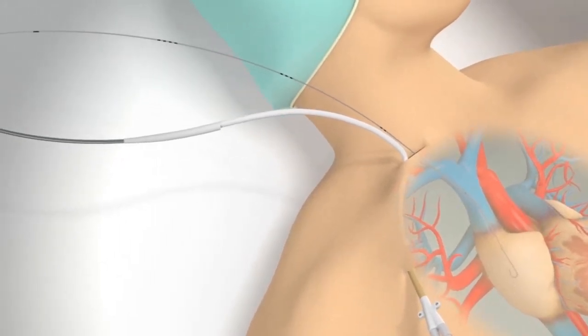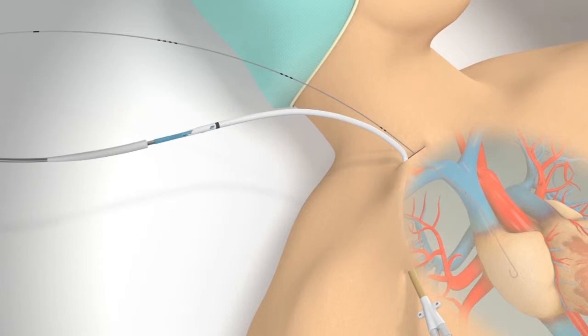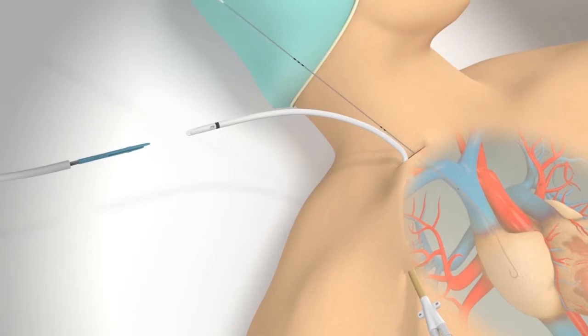Remove the catheter carefully from the tunneling stylet. First, slide the sheath of the tunneler back. Next, grasp the tip of the catheter and gently pull the catheter from the tunneling stylet. Discard the tunneler. If using the micropuncture kit, withdraw the 5 French coaxial dilator, leaving the guide wire in the vein. This is not necessary when using the 18-gauge introducer needle.